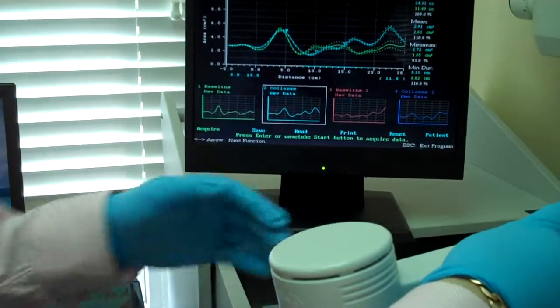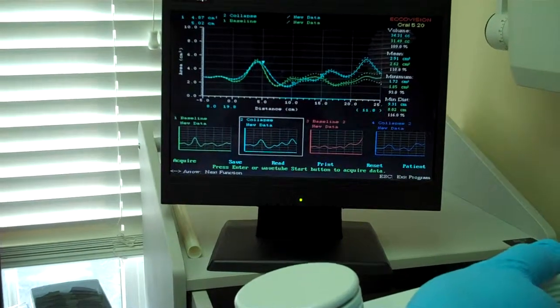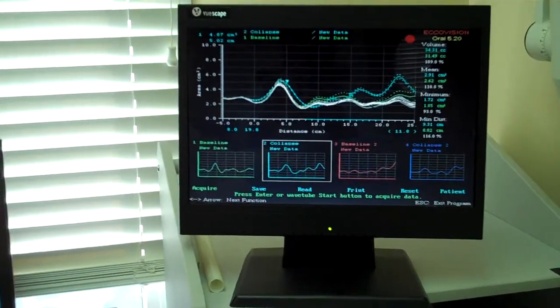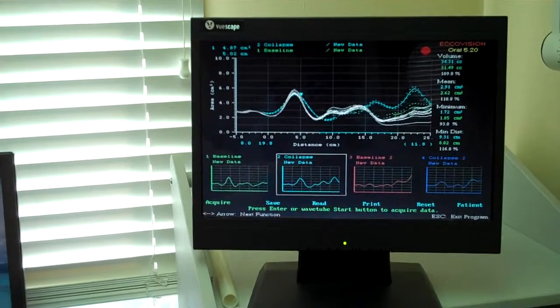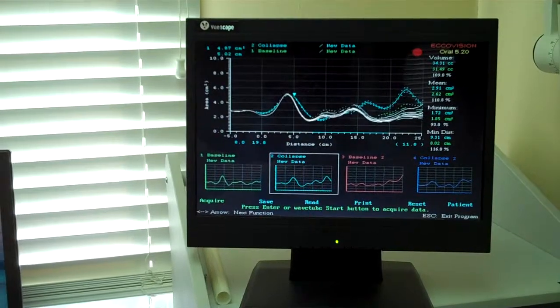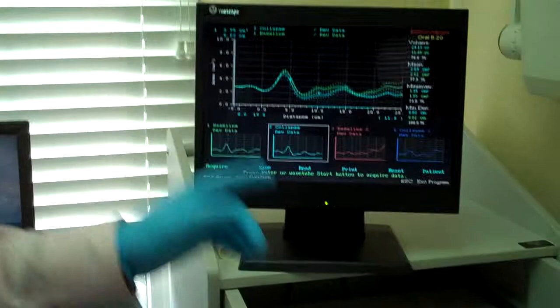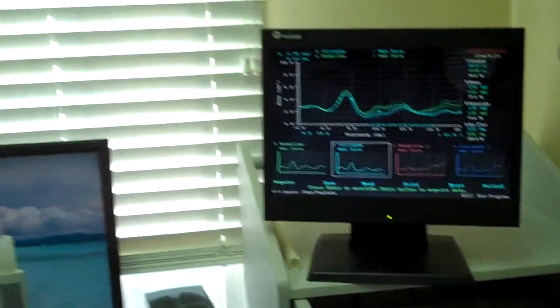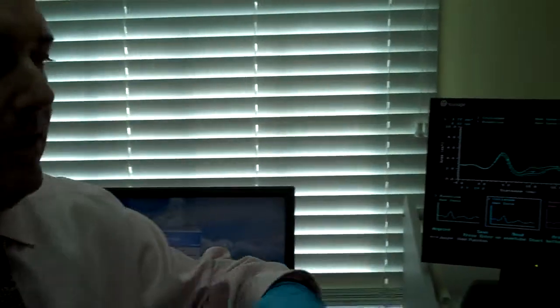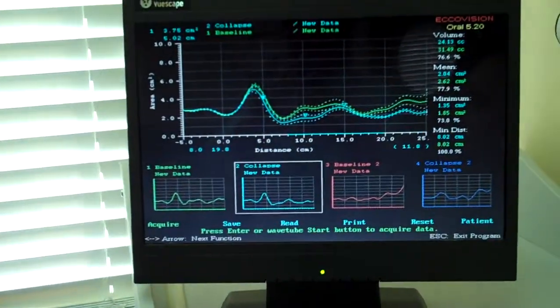Now what we're going to do at this point is ask you to take a nice breath in and slowly breathe all the way out. Go ahead. Through your mouth, not through your nose. And as he breathes all the way out, raise your hand when you can't breathe out anymore. What we're simulating is what might happen to a person at night. You can go ahead and relax now. We're simulating what might happen to a person at night when they're sleeping and their body completely relaxes and their airway shuts off. In this particular instance, we find that when he breathes all the way out, his airway is about 30% lower than it is when he is breathing normally.